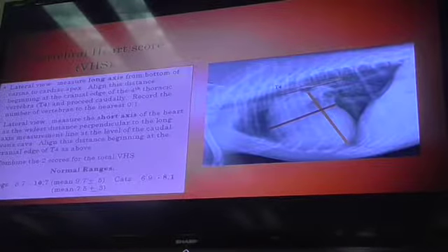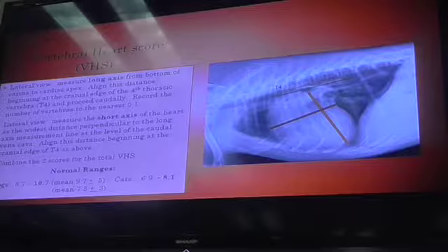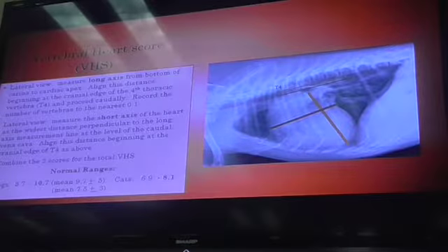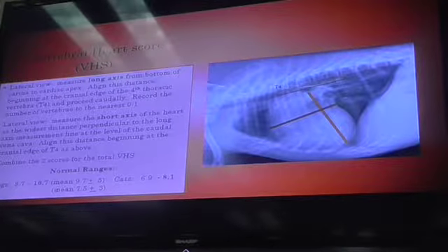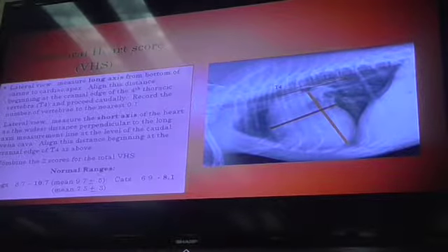Somebody else? Yes. You stated earlier that we're going to count from T4, the vertebral body, you said? You counted until about 4.5 steps? 5.5. 5.5. For the long axis. Okay, and then you said 6. Where did the 6 come? The short axis. Okay, so you mind?